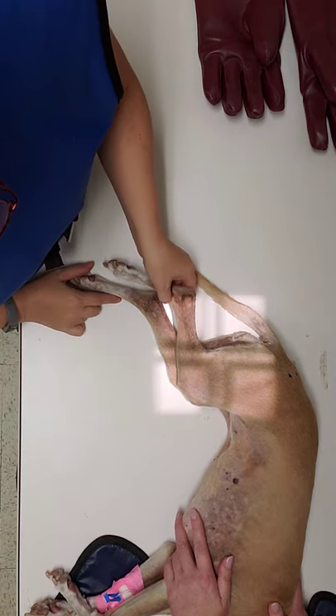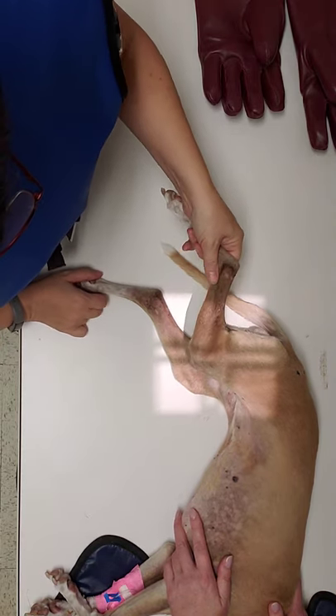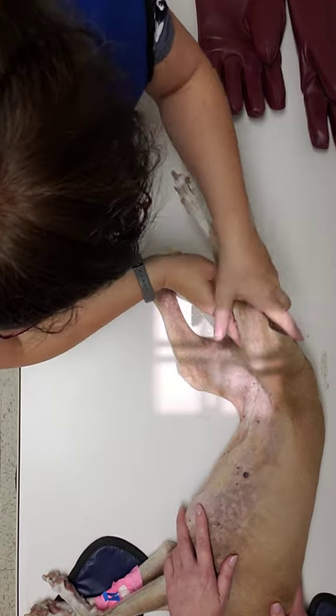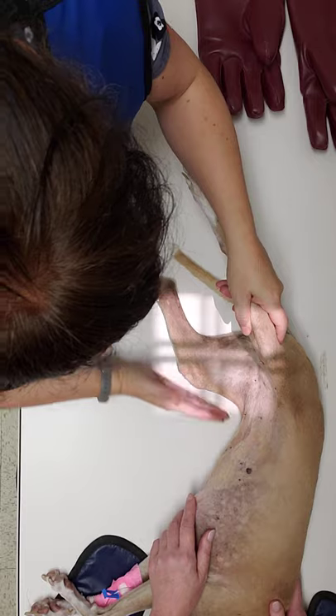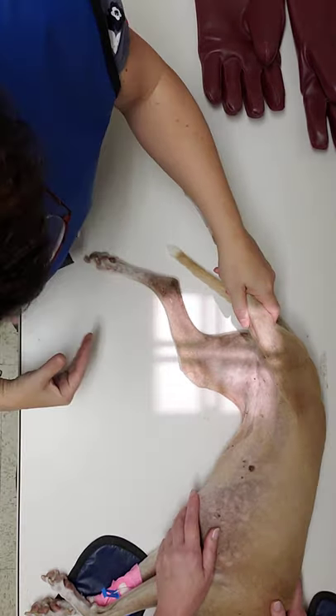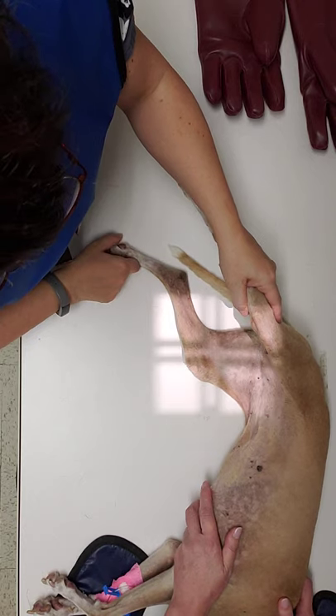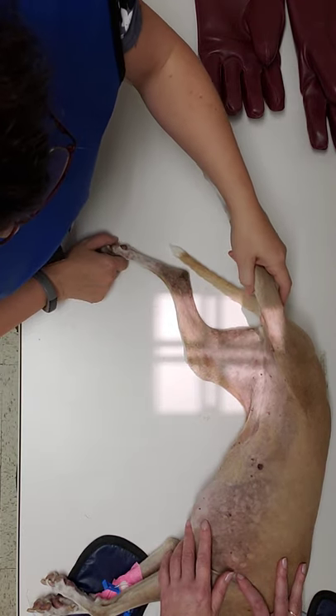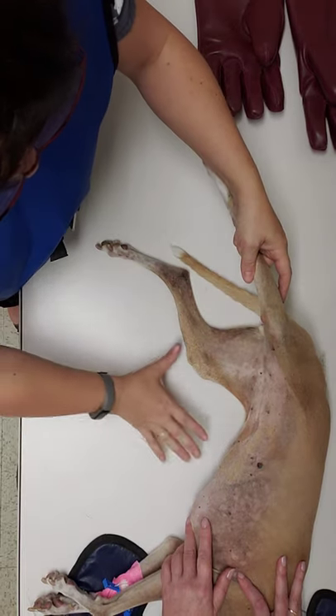We're going to go ahead and measure the light so that her knee is pretty much the only thing in this image. We can shrink it just a little bit more, but I'm okay with this kind of collimation. You have the whole thing in and you have about an inch on any one side of it.